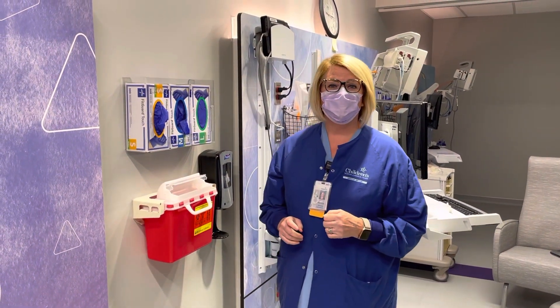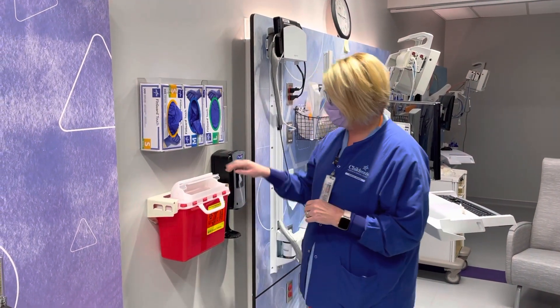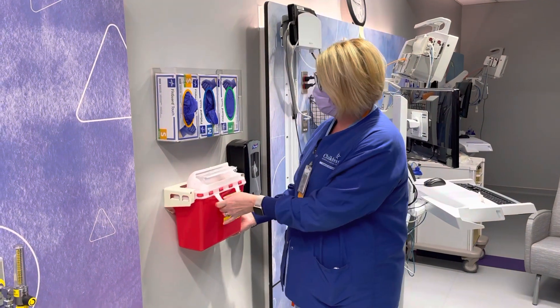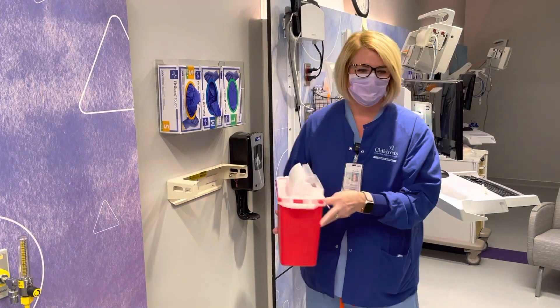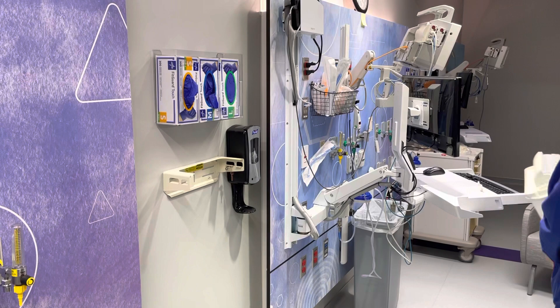We're going to be replacing a sharps container. First, we need to unlock the sharps container to remove it. When you pull it out, you're going to pull on this end first, and then it just comes right out of the holder itself.